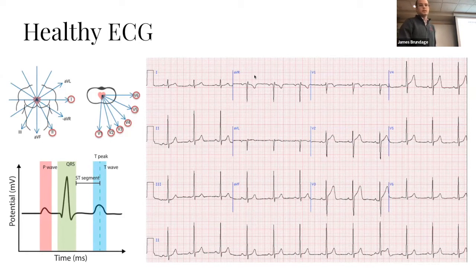So for example, the best thing to look at here is this aVR. This image is showing inverse aVR. So the actual aVR lead is measuring this direction, and the heart's electrical conduction is actually moving in the opposite direction of this vector of measurement. And so we can see here that our QRS complex is deflected in the opposite direction as some of these other ones. But that's a totally normal finding based on what we're measuring. What I want to get an appreciation of is that these different leads can tell us different things about the heart and have slightly different perspectives.